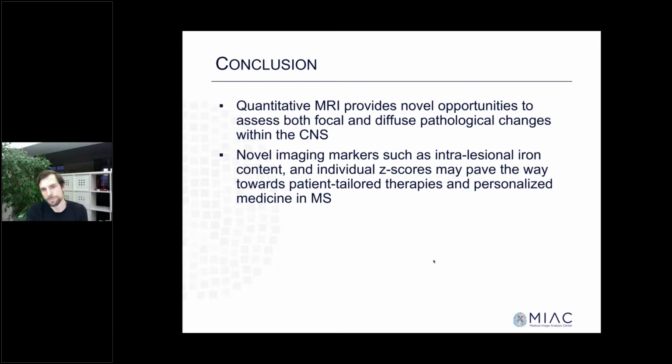Yeah, that's an important question. Just by looking at the cortex when you have T1 weighted or T2 weighted scans or MRIs, you will only see the tip of the iceberg of cortical lesions, and you will miss for sure the majority, even at 7 Tesla. Especially the subpial lesions are very hard to detect. And even if you have a very high resolution 7T scan, you will not see the base of the subpial lesions in many cases.